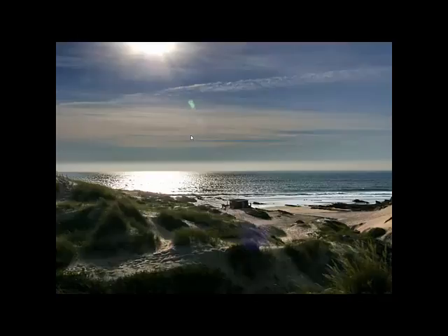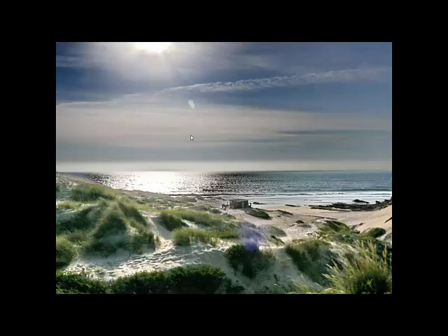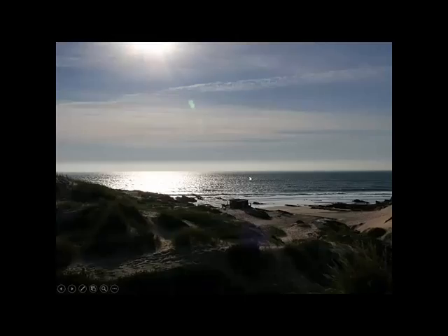We can also over-process and do more than we should, like here. On a picture like this it doesn't really hurt, but on a medical picture this over-processing includes some dangers. Here for example we see a black artifact. If I go now to the raw image, this does not exist.